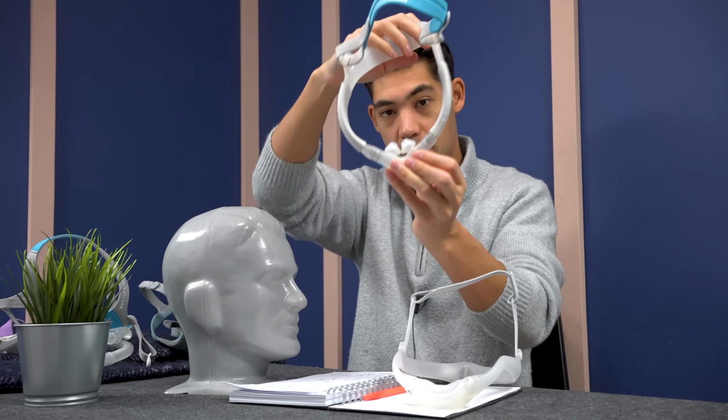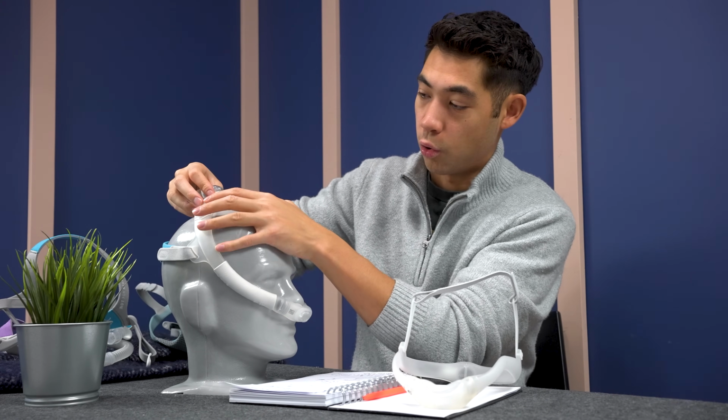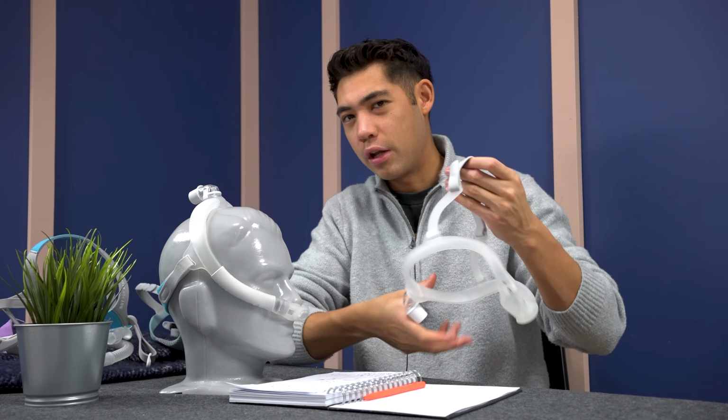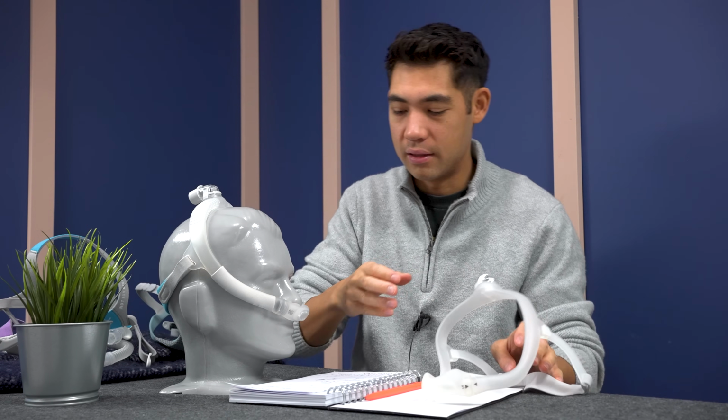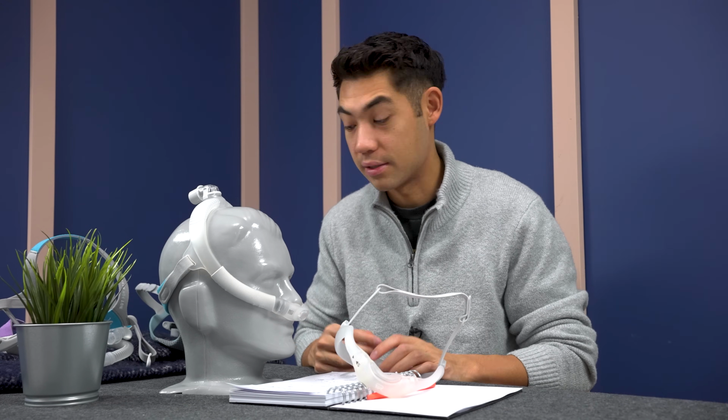The P30i, here's the pillows here. It's a very similar mask, except it has this kind of accordion style, more flexibility there. But I just feel like the Cradle version is better in the Dreamwear and the pillow version is better in the ResMed. So there you have it for the top mounted masks.